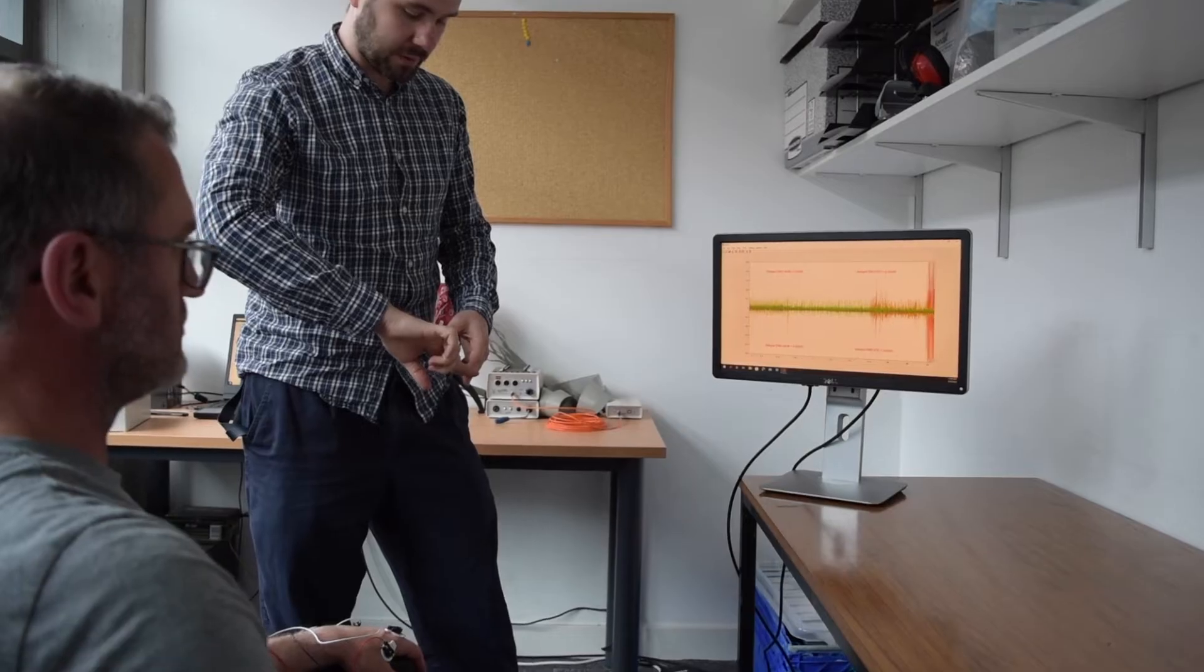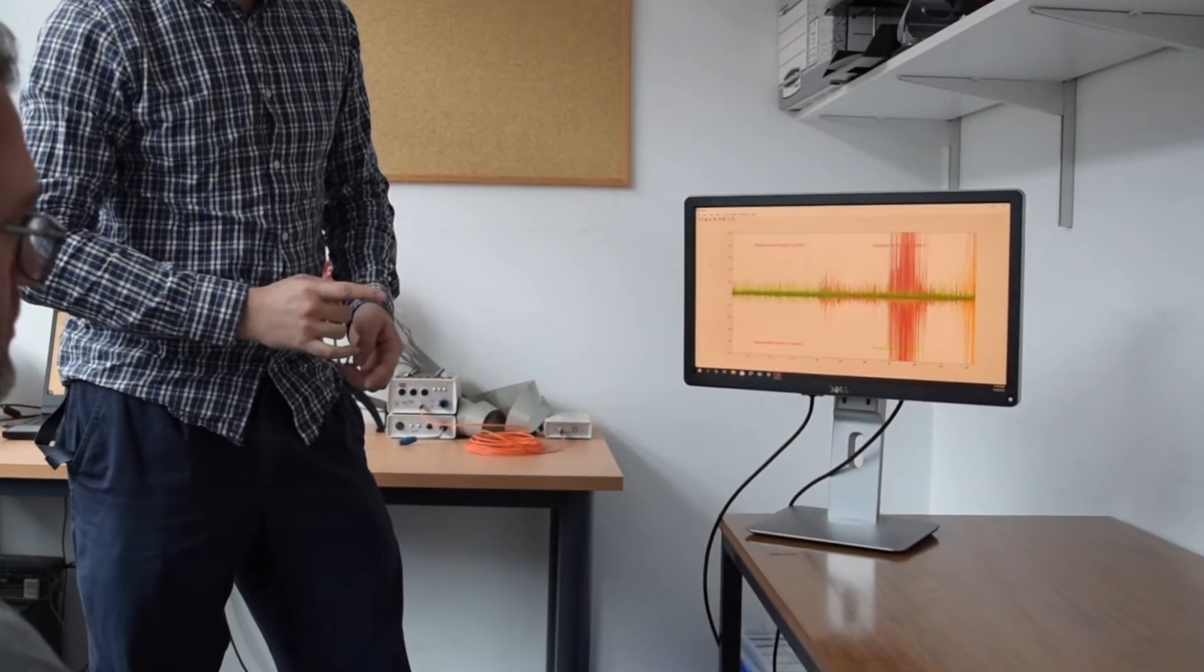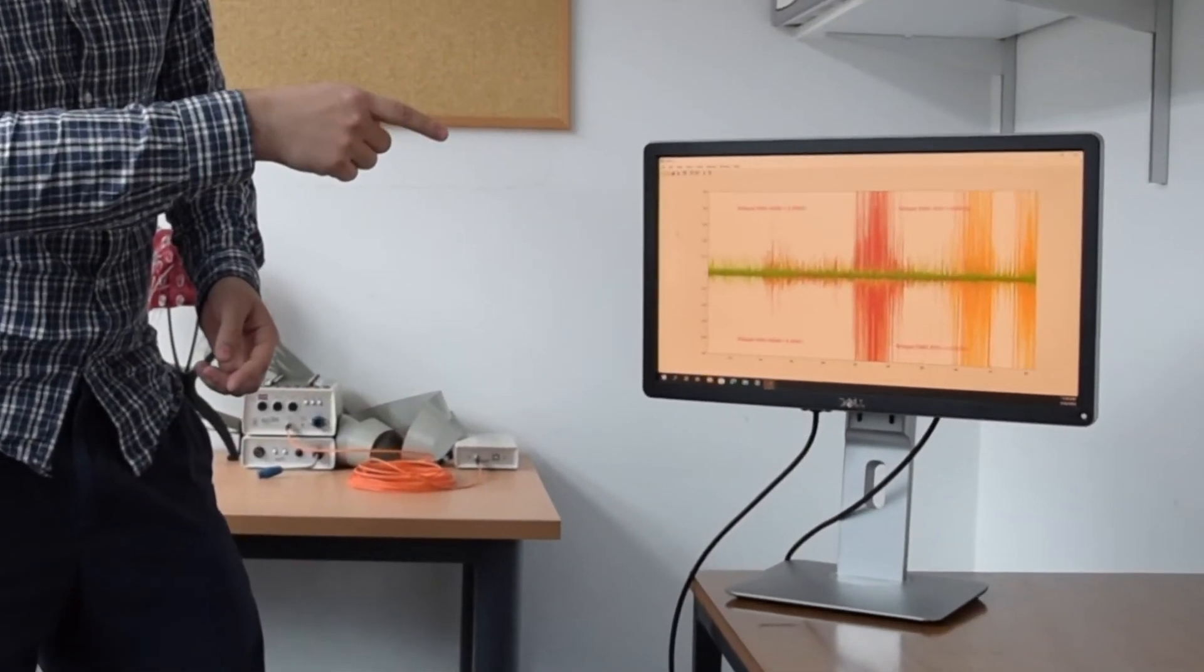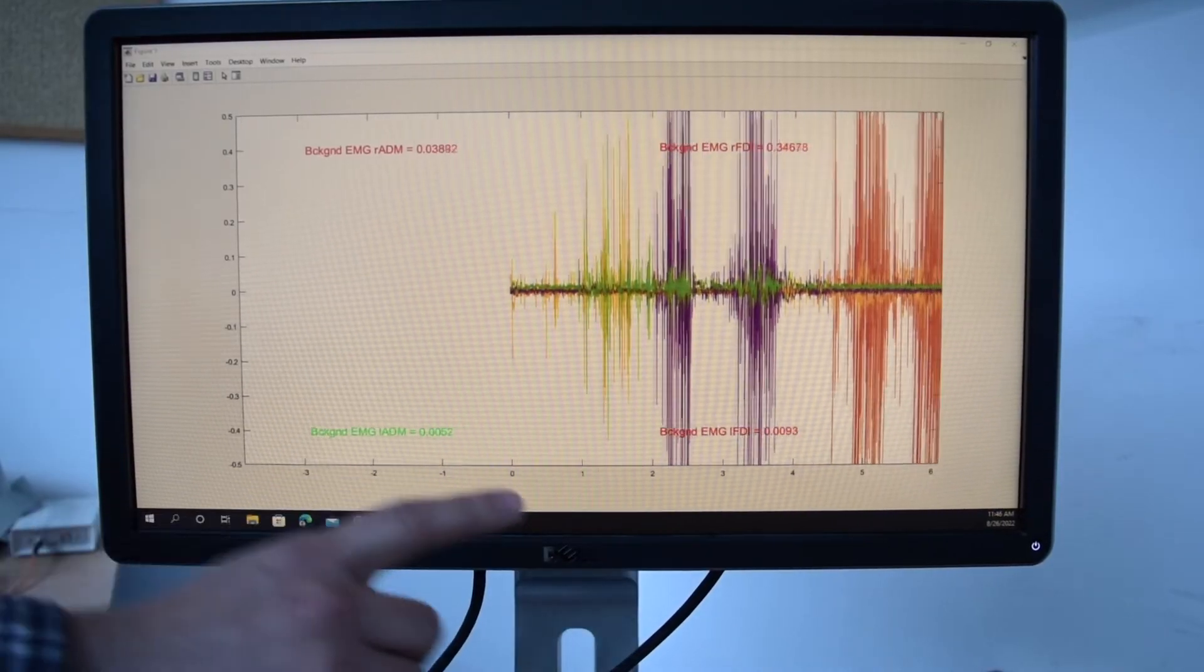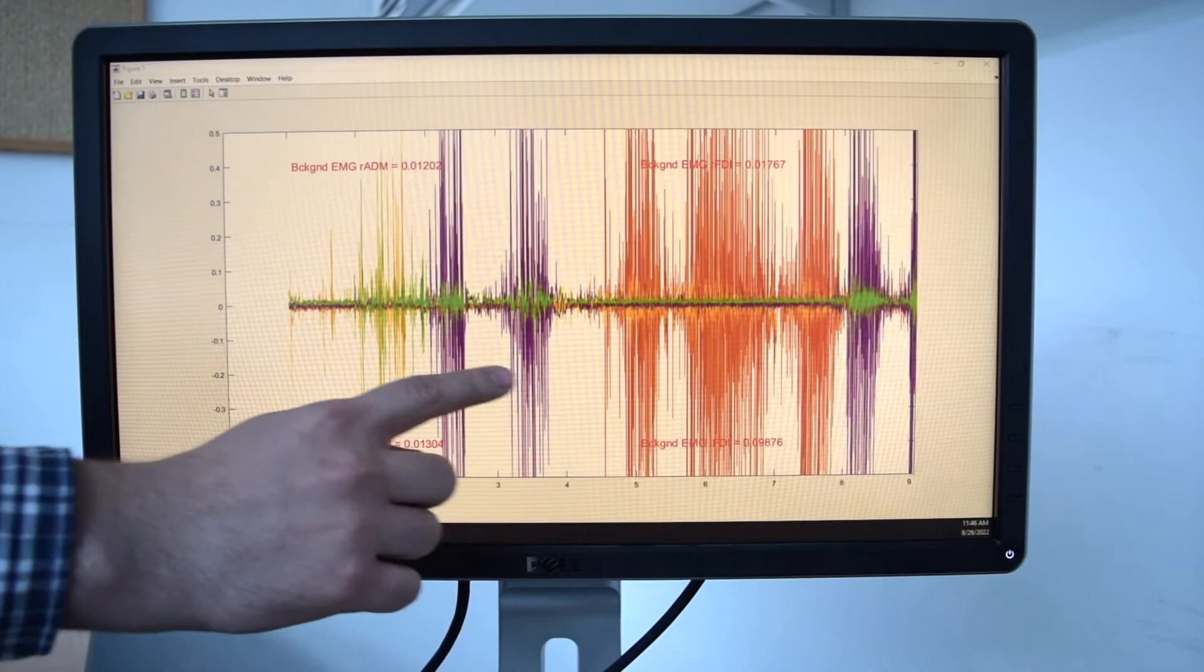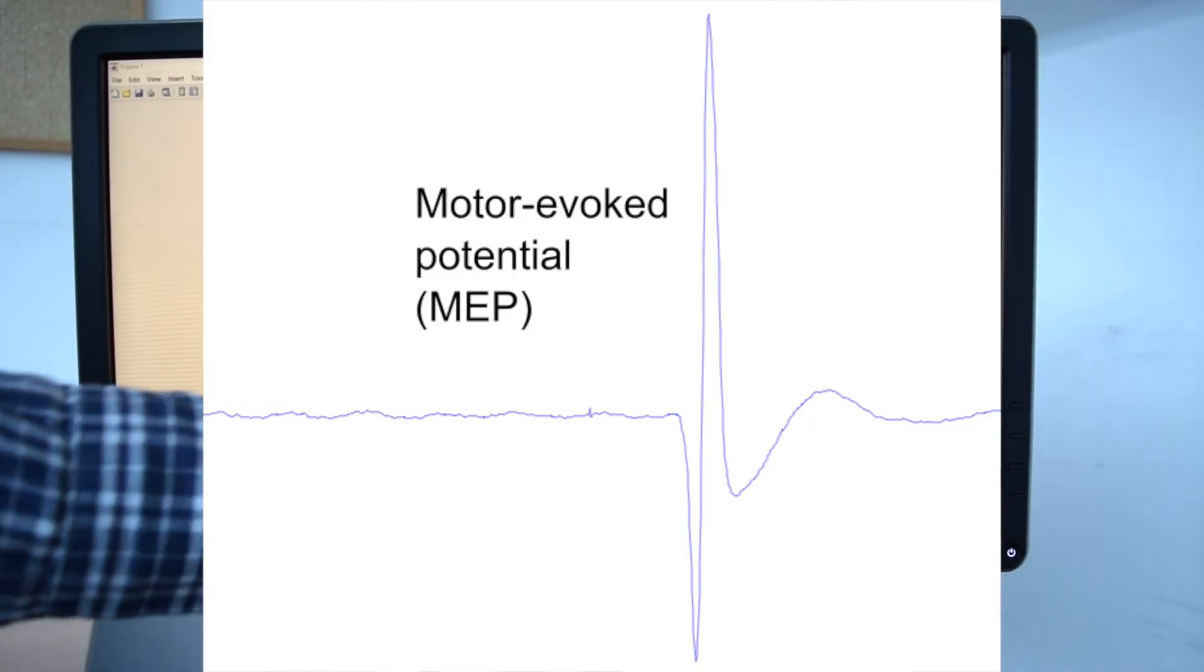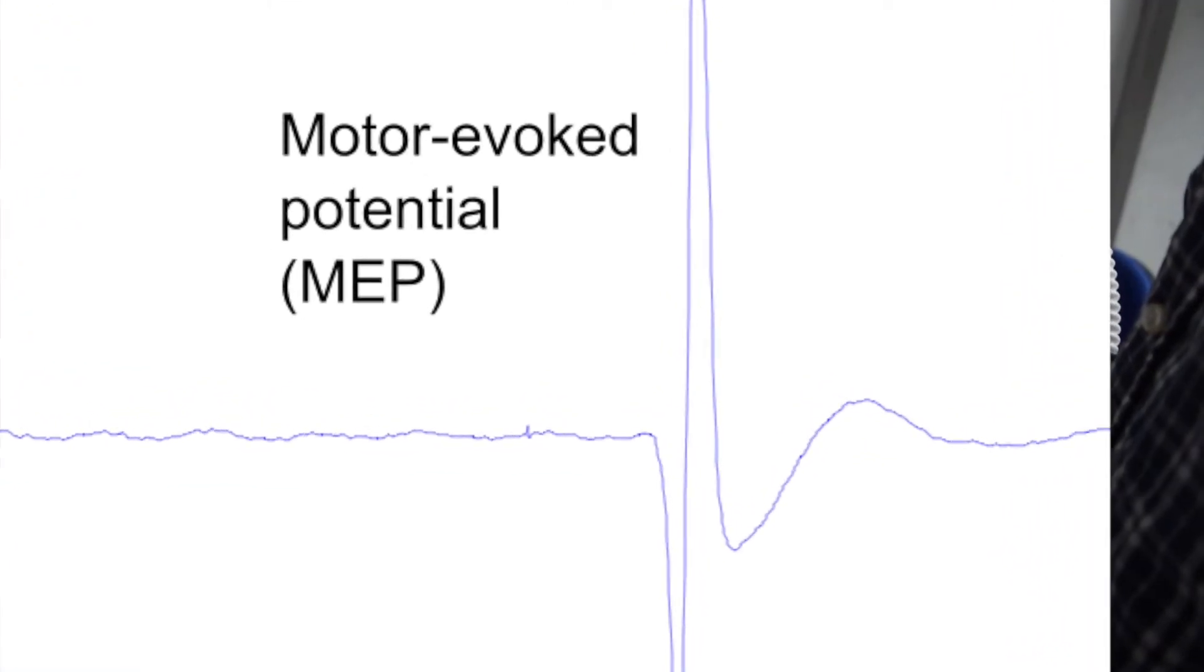Often the twitch is so small that it is not observable to the naked eye, so we need to record the electrical activity of the muscle using electromyography. With this technique we can visualize the evoked response in the muscle as a result of the TMS, and this is called a motor evoked potential or MEP.